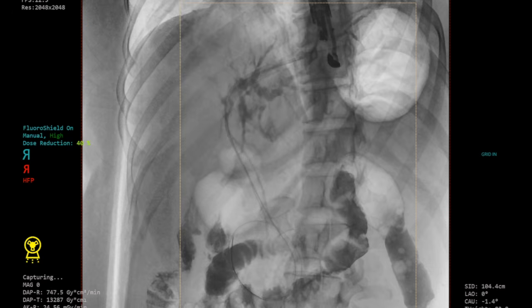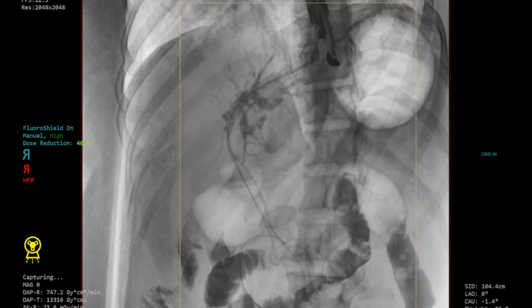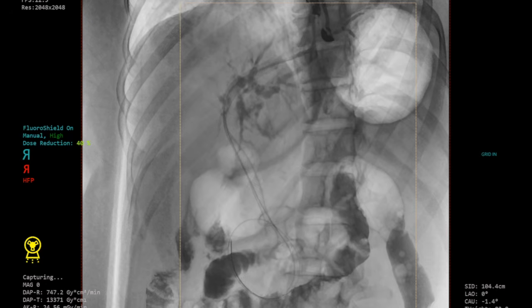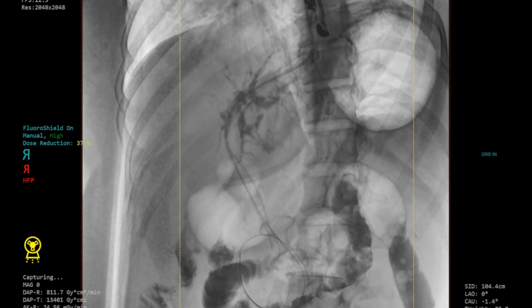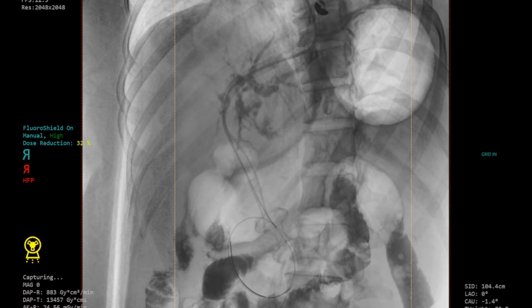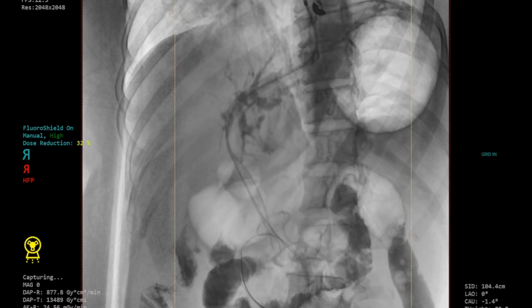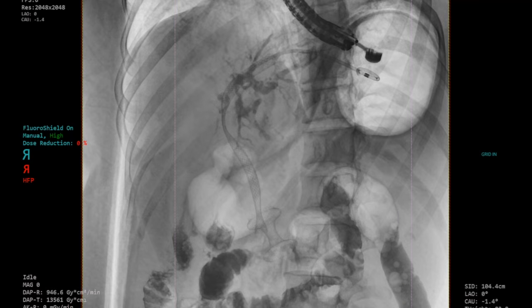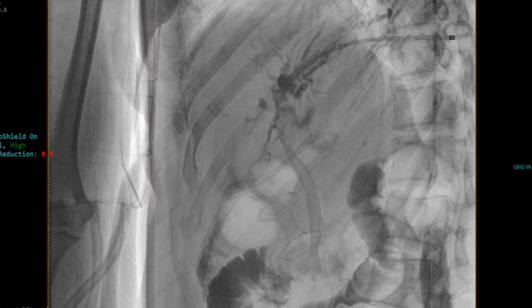In this case, to minimize a bile leak, we placed a 7 French single pigtail plastic stent across the transgastric fistula, although oftentimes this is not required. Note that the entire procedure was performed only on sonographic and fluoroscopic view. Also, note that the fluoroscopy tower was rotated oftentimes to provide magnified and unmagnified images to facilitate different intraprocedural maneuvers.